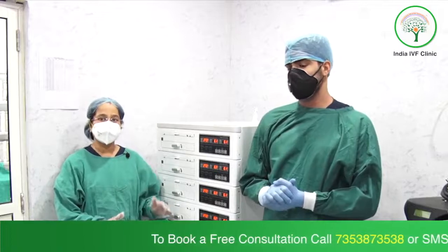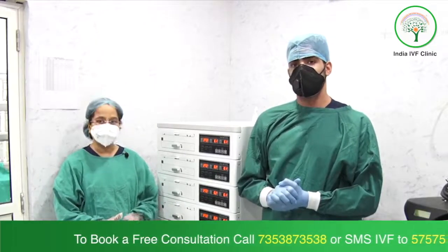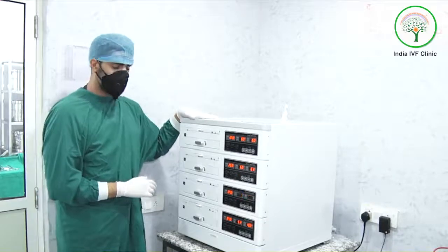Our senior embryologist, Mr. Abhinav Dudeja, is going to clear all your queries about this incubator — how it is a good incubator and how it is different from other incubators. This is our Aztec cube type incubator.